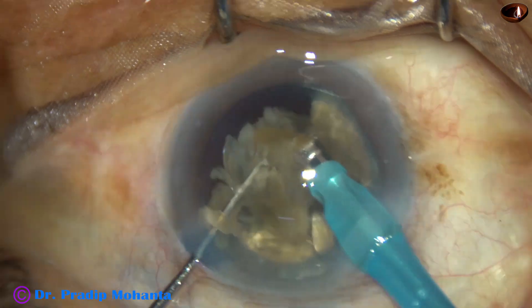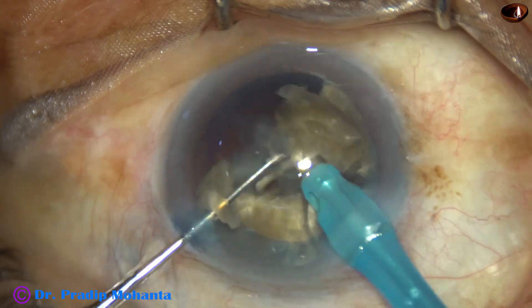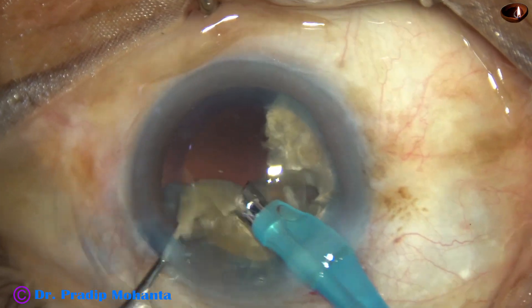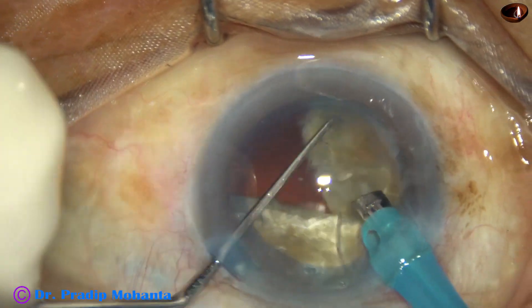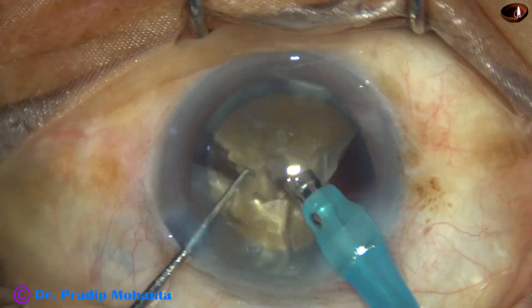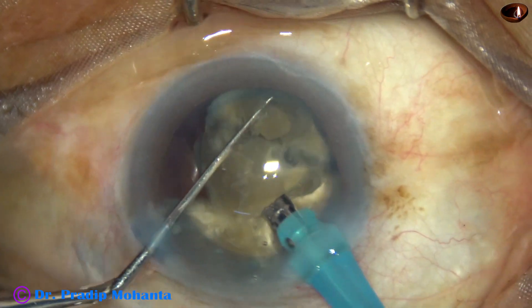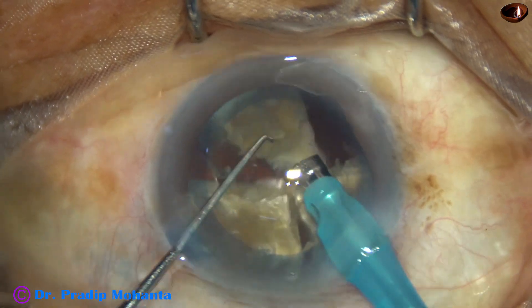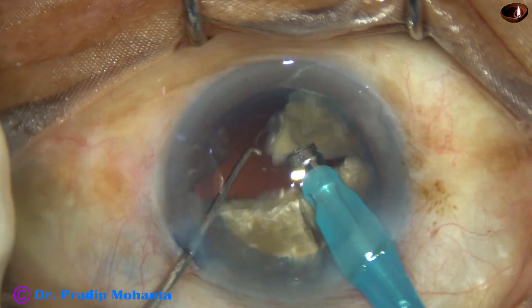Now the pieces are emulsified. Ultrasonic energy used from the very beginning is 80% in this case. Flow rate is 45 ml per minute and vacuum is 450 mmHg. At this time we must watch the behavior of the posterior capsule.